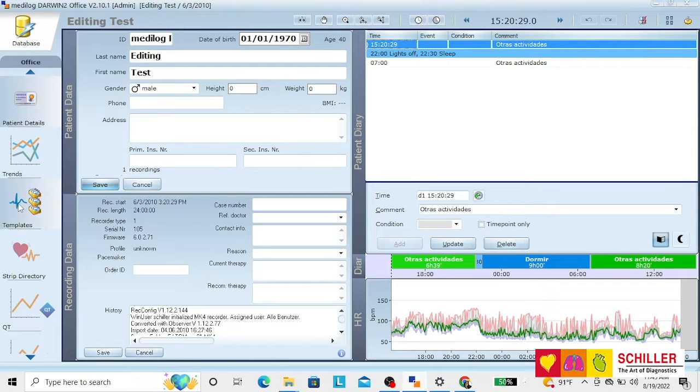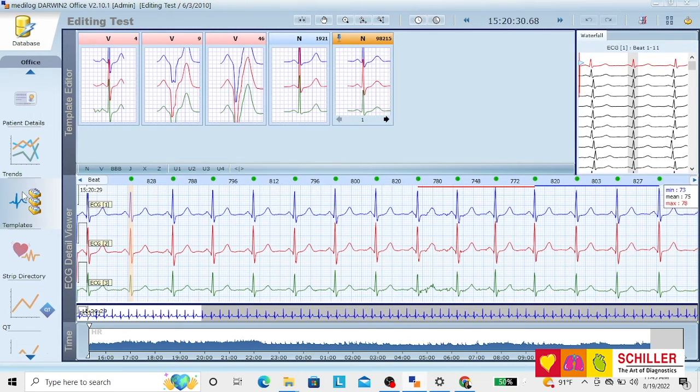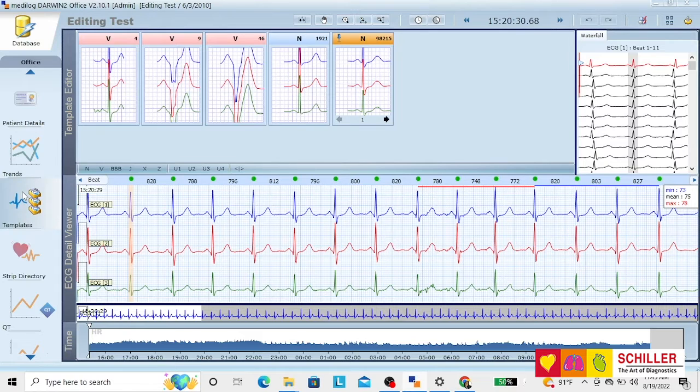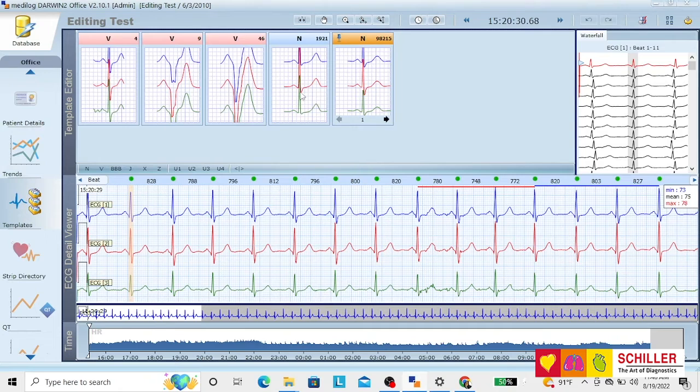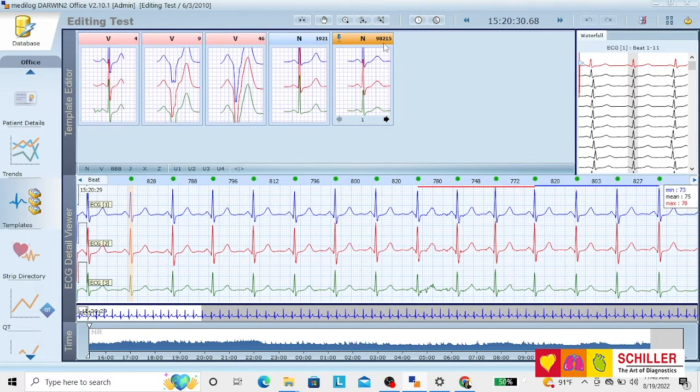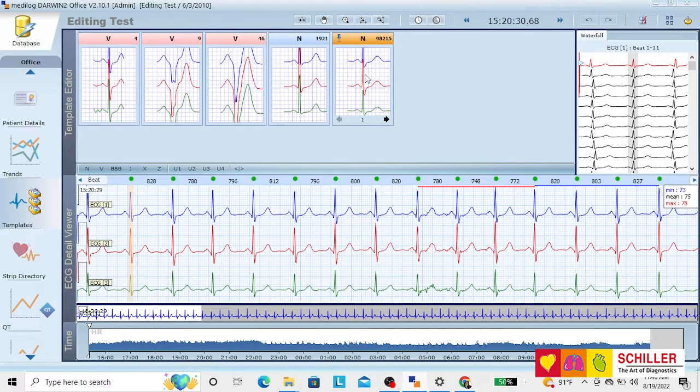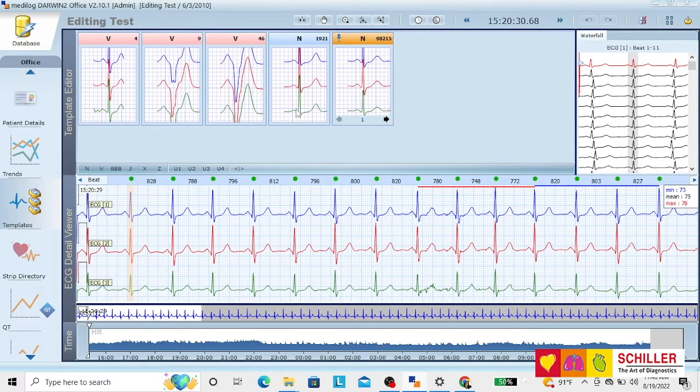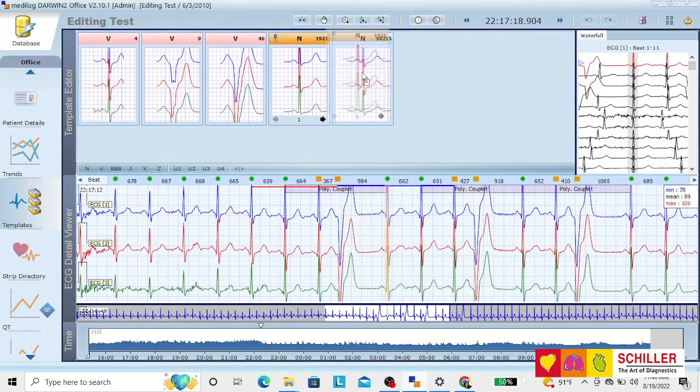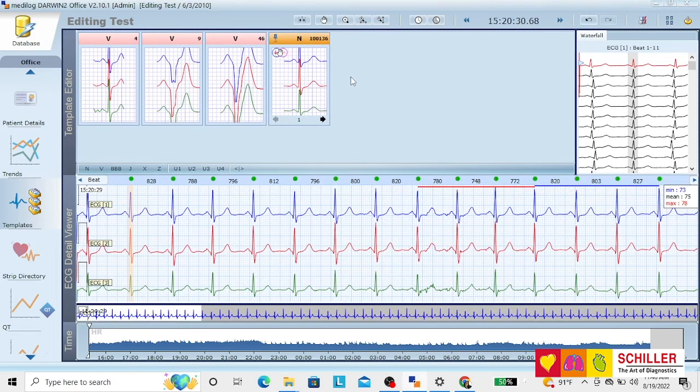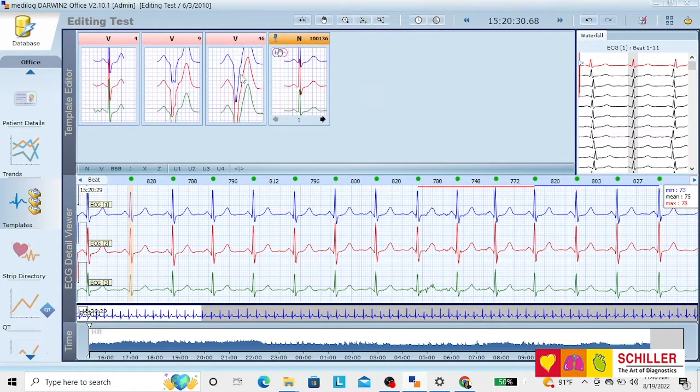On the template side, you will have the different morphologies that have been detected by the machine. You will have the normal beats. This number up here is the number of beats with this same morphology. We see that they are not abnormal. Just click and drag so that you unite them.